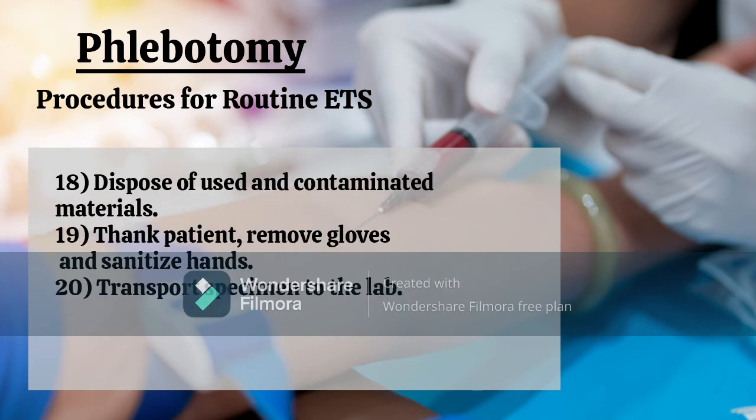Procedures for routine ETS. 18. Dispose of used and contaminated materials. 19. Thank patient. Remove gloves and sanitize hands. 20. Transport specimen to the lab.